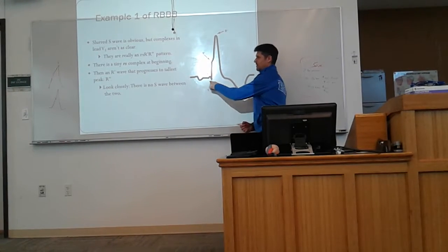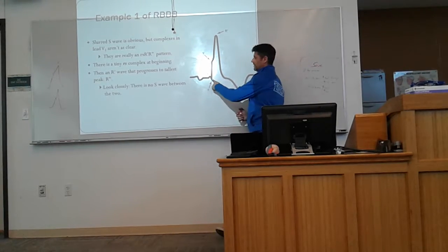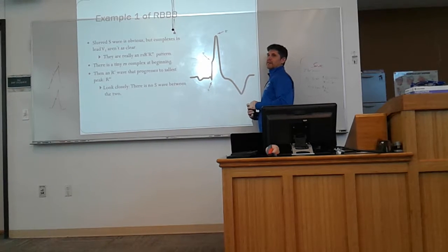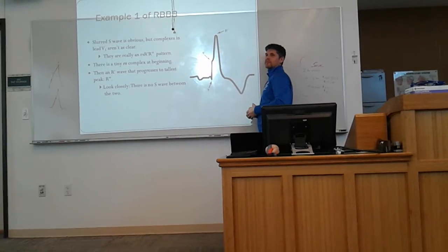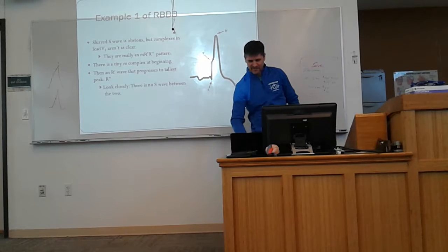So are you going to go through that reasoning every time? Of course. But I know it's an S wave because it comes after the R, so it's not a Q wave, so I don't have to worry about it at all. And even if it was a Q wave, it doesn't meet any of the criteria to be pathologic. Now you're worried just because it looks bananas. Good? Bananas?